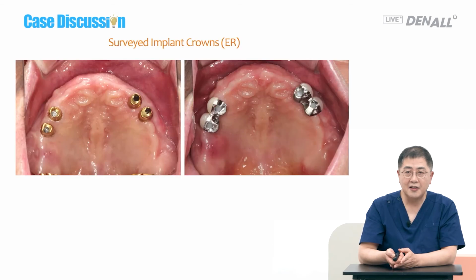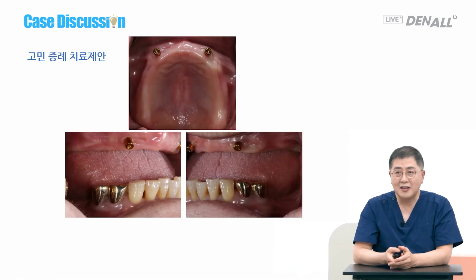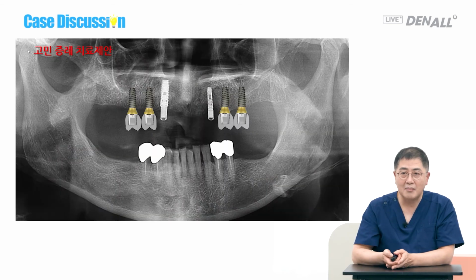So surveyed crowns are made. OSSTEM has an ER type with holes in the prosthesis. So from here, it's a general RPD. The patient is using it really very well. Considering this, if you look at the case under discussion, my favorite implant RPD can be used. This is a denture. It provides lip support and good function.